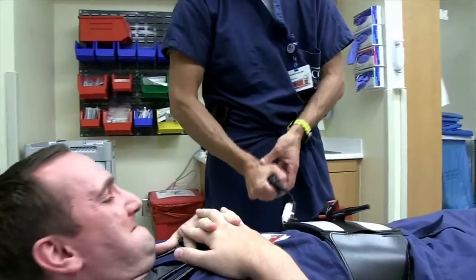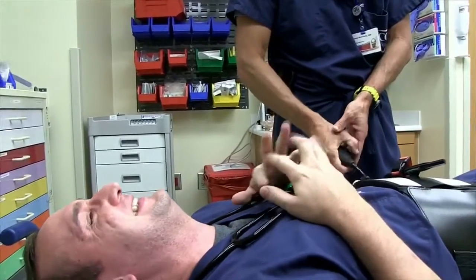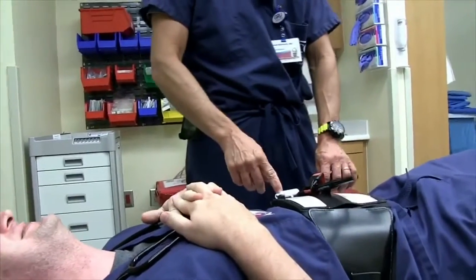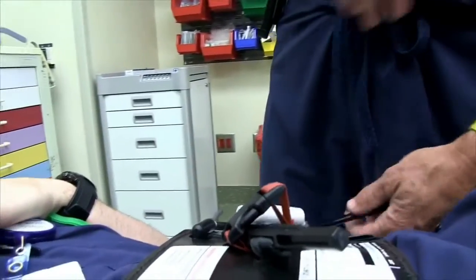What you do is you inflate — now his face is getting redder. Does that mean there's more blood flow? So we're there. We're at the inflated point — up to green. We'll take it down.